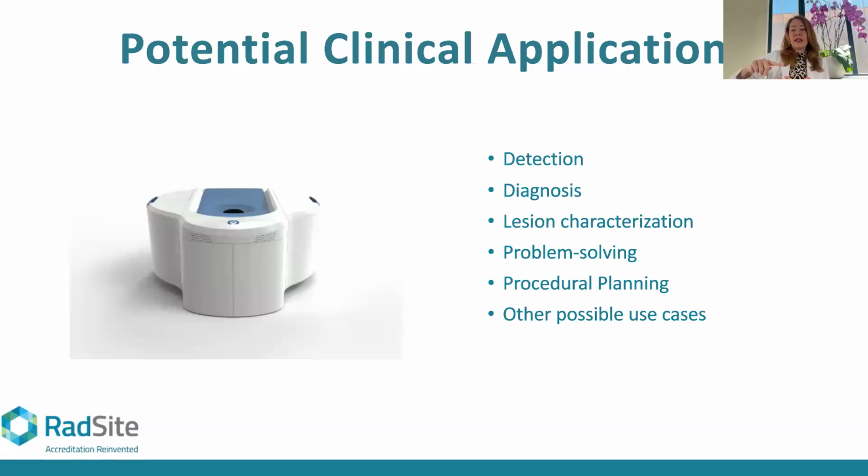Now, undergoing either of those other options, to try a lumpectomy first or to do a tissue sample to define the extent of disease, both of those things were completely correct and completely reasonable options. But it was such a huge relief to see this amazingly accurate picture of this disease pattern. That, and invasive lobular carcinoma is notoriously difficult to find.